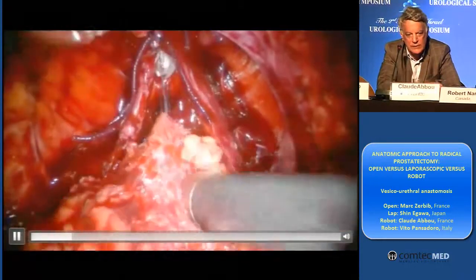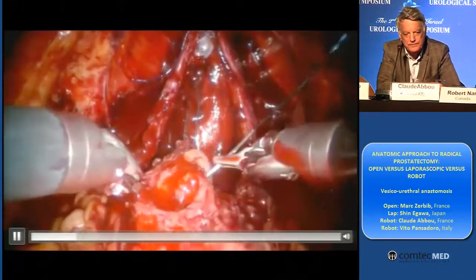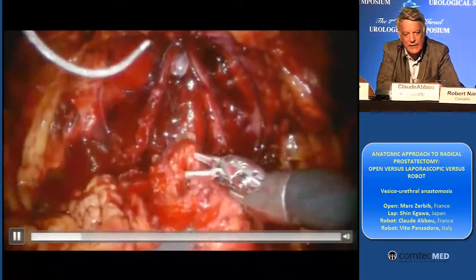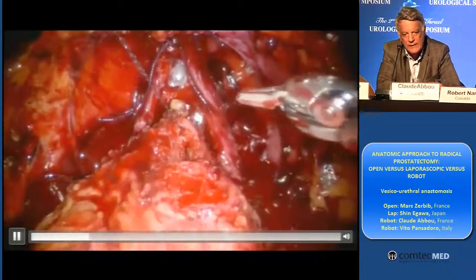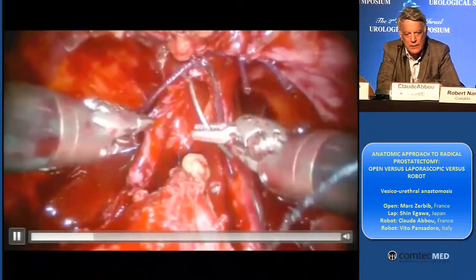I use the V-lock, but there are other sutures that can be used. And then in this patient, we approximate immediately the bladder neck to the urethra. And then it will be stable, and then you can continue on one side and then on the other side.